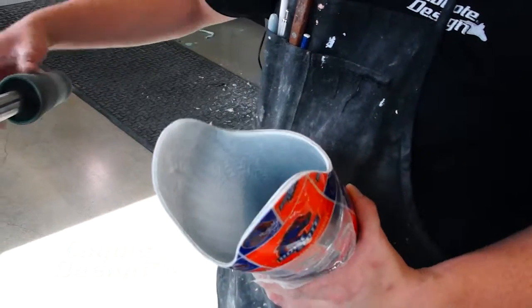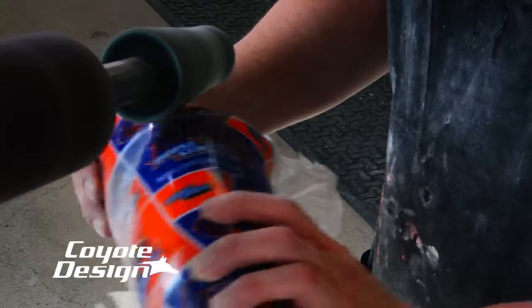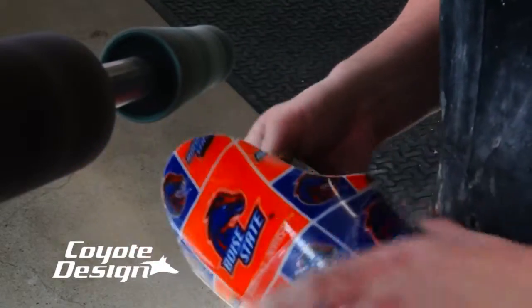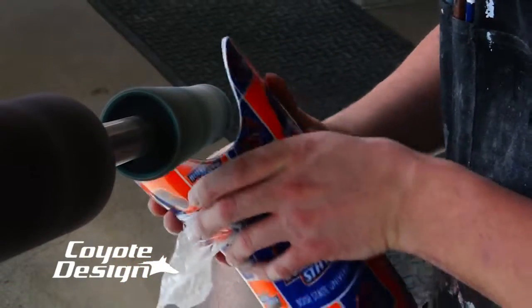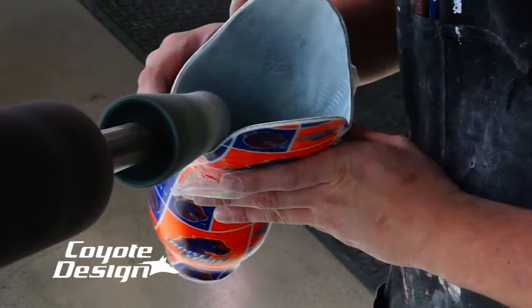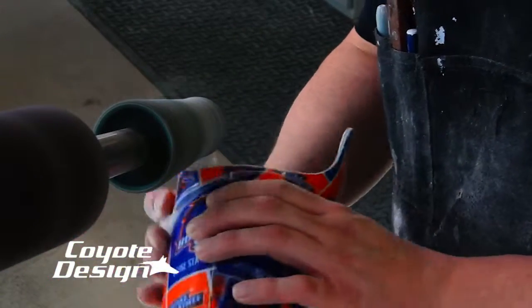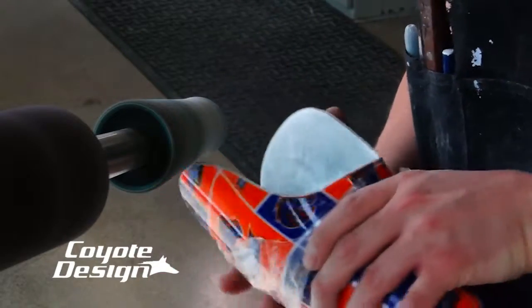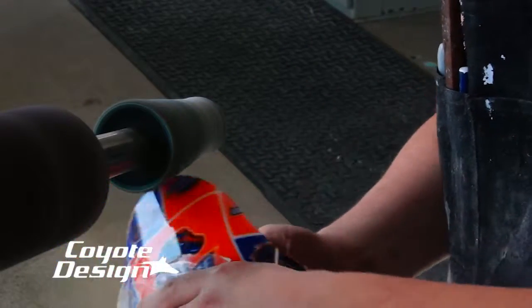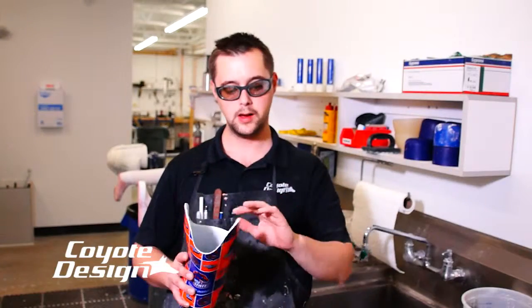Then you go ahead and take a medium buffing cone, which is a blue buffing cone. I start with the outside edge, kind of start rounding it off. Starting with the outside, then I go back in with that cone, then I go outside all the way around, buff it, and then I go inside. So you're trying to create a smooth, round edge — not a square edge. You don't want any square edge. A square edge is going to make it sharp.